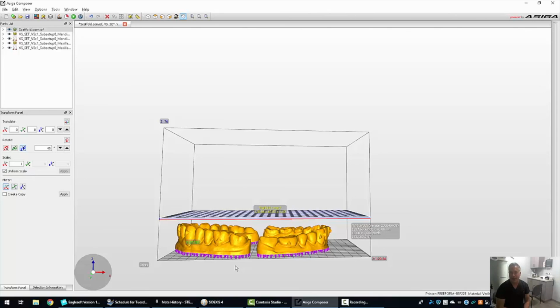When we have a print failure, where is the print failure? The print failure is in between the bottom of the resin vat and the build plate, and that layer not sticking. Now, if I print a model horizontally, I've got very few slices. But if I print a model vertically, I've got a lot more slices. Well, imagine with this, I'm printing vertically and then printing vertically again. So again, there's a ton of cool features in the software. I just think it's a little unnecessary.